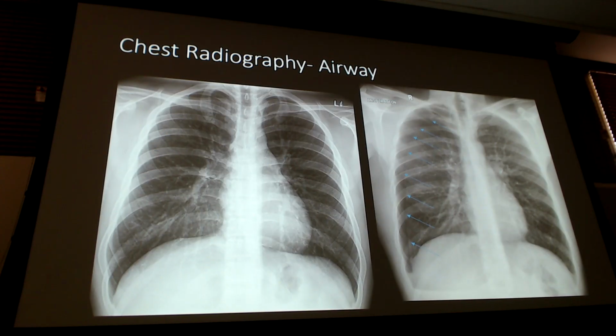Now, if I wanted you to just have the x-ray and not decide between simple or tension and just ask you to identify pneumothorax, you don't need vitals because you're just finding pneumothorax. I'm not asking you to differentiate between the two.